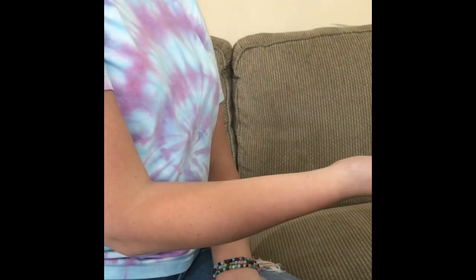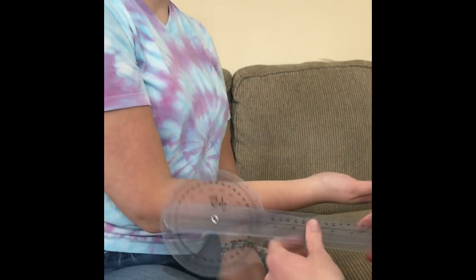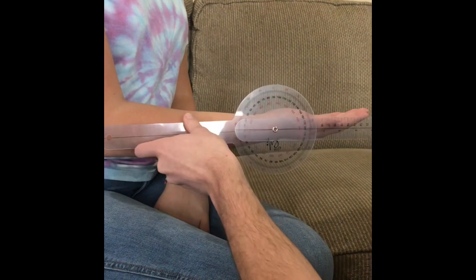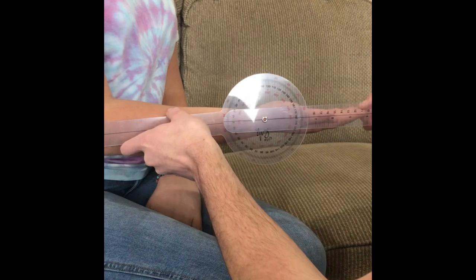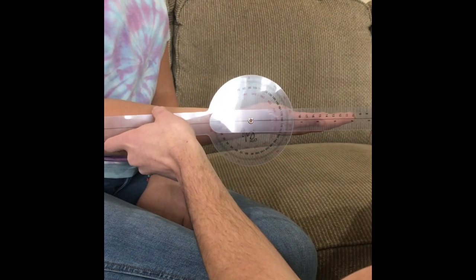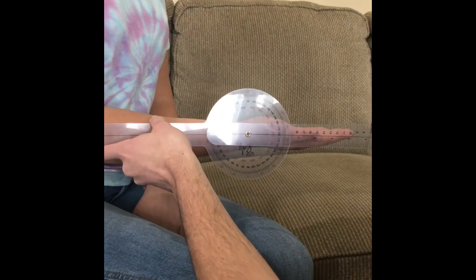All right, now we're going to be measuring wrist extension and flexion. So you're going to have your patient hold up their arm horizontally like so, making sure that the wrist is horizontal with your forearm. Your movement arm is going to be on the edges of the finger, and your stationary arm is going to be equal with the forearm like so. And then you're going to be using the distal phalange of your middle finger to measure it. And when you're asking your patient to extend or to flex, you want to make sure that they keep their fingers straight at all times.